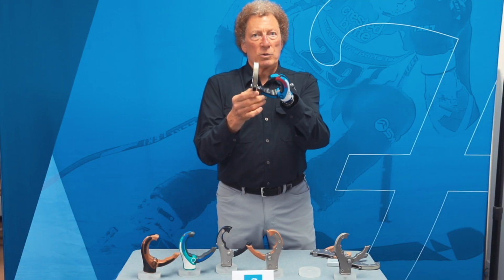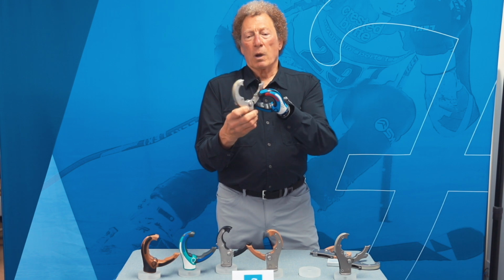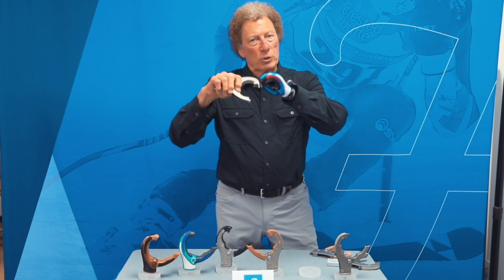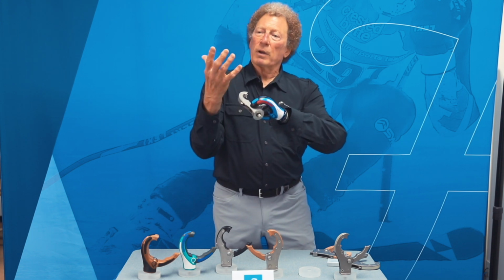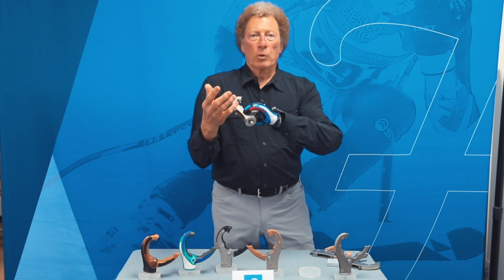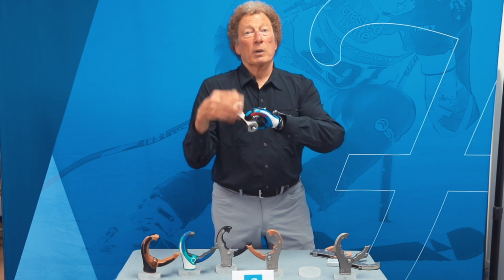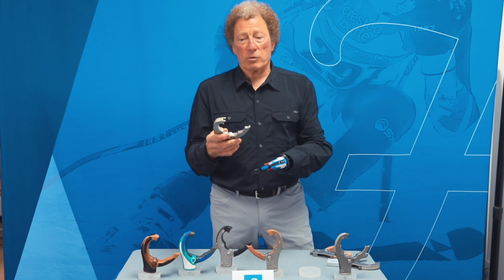Also the narrow design. All of these grip devices that I'm going to show you are narrow in nature. That allows you to get at things. You can manipulate things a lot easier. Unfortunately, the hand, as good of a tool as it is, when it's made into a prosthetic device, can be very cumbersome and clumsy. So having a narrow design to these devices really enhances their functionality.